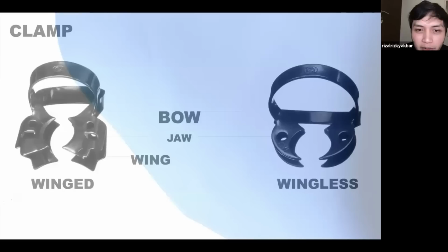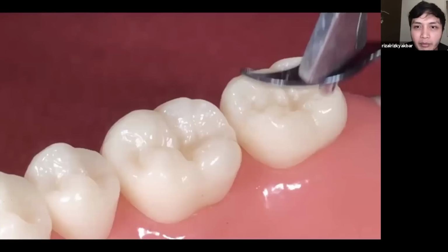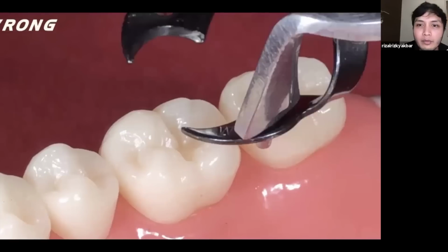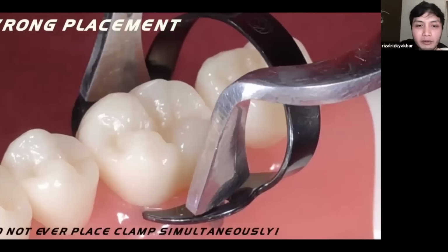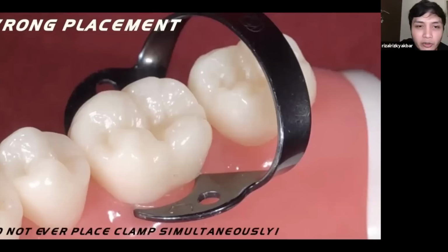How about the clamp? There's a wing or wingless clamp, but I really love the wingless clamp. This is the wrong placement of clamp. You know, placing a clamp is a nightmare. That's why people are really afraid to use rubber dam, because they are afraid to put the clamp. But let me tell you something, it's really easy to put the clamp.